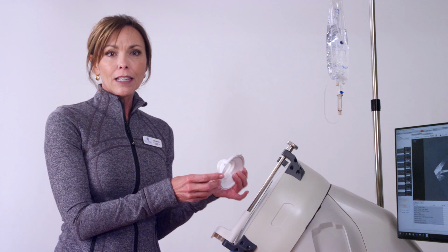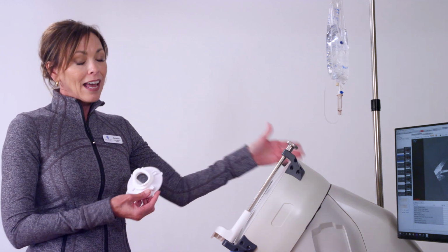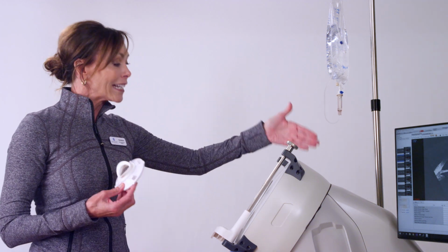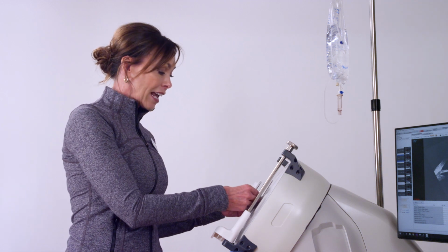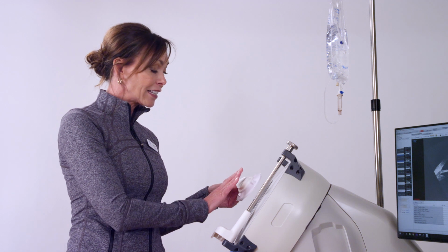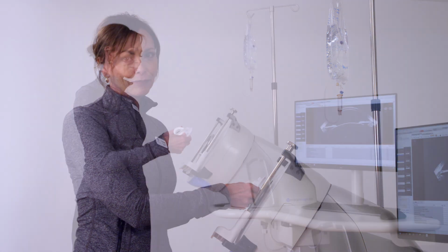The clear membrane here acts as a barrier between the distilled water within the scan head and the saline in the small cup. So you have distilled water inside the scan head, the EyeSeal against the scan head here, saline within this cup, and the patient's eye against the EyeSeal, immersing the patient's eye in the water.